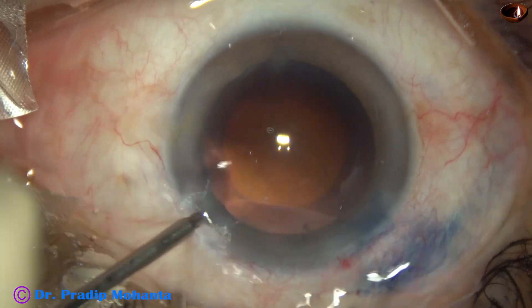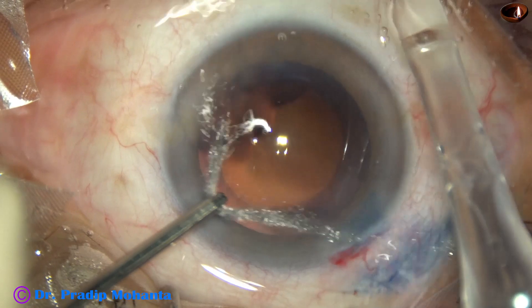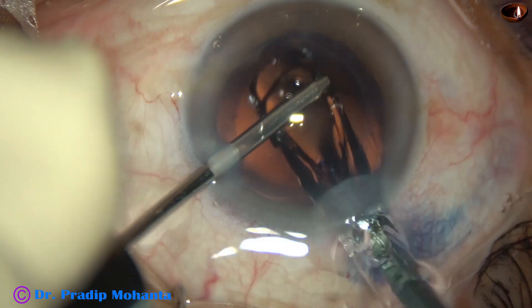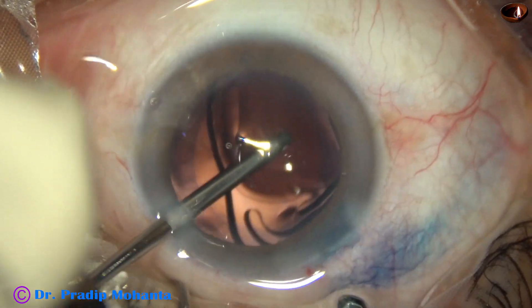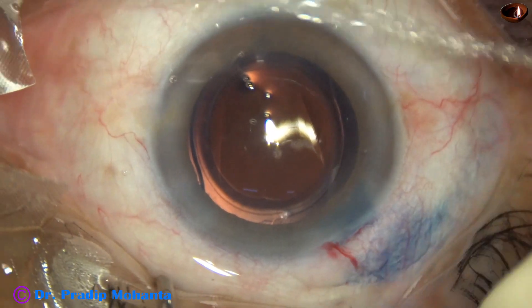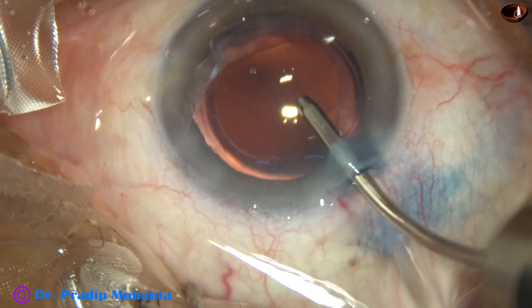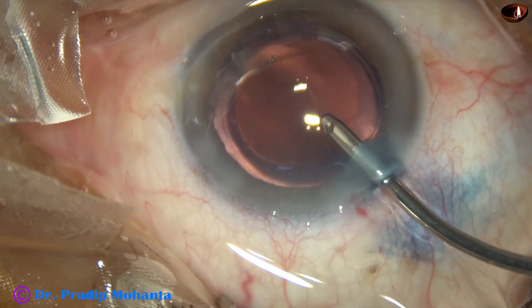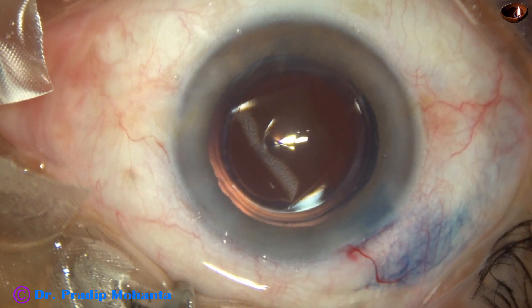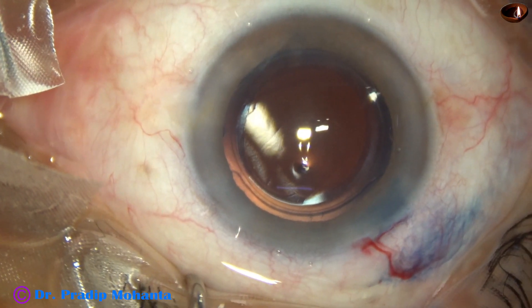I am enlarging the main incision a little bit, so the size of the main wound is about 3 millimeters now. Here goes the intraocular lens. The lens is nicely in the bag. The optic is overlapped all around by the anterior capsular rim, and it looks nice.